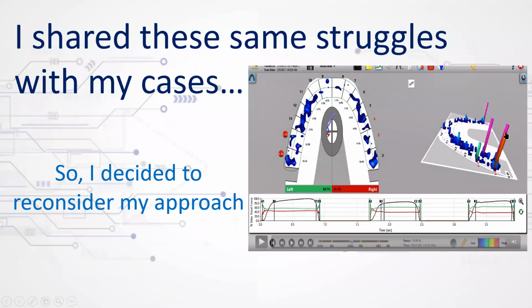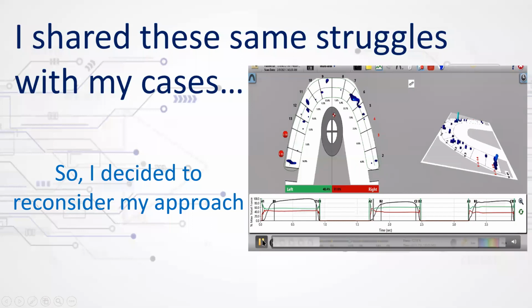And it isn't only the highest forces, it's also the timing. As I said, contacts like this one, which rise too fast, may not reach full force. You see, that one doesn't get as high as the others. It actually lessens over time. And that happens in fractions of seconds, which you would never be able to see. This movie itself, what you're looking at, is maybe 0.3 of a second.